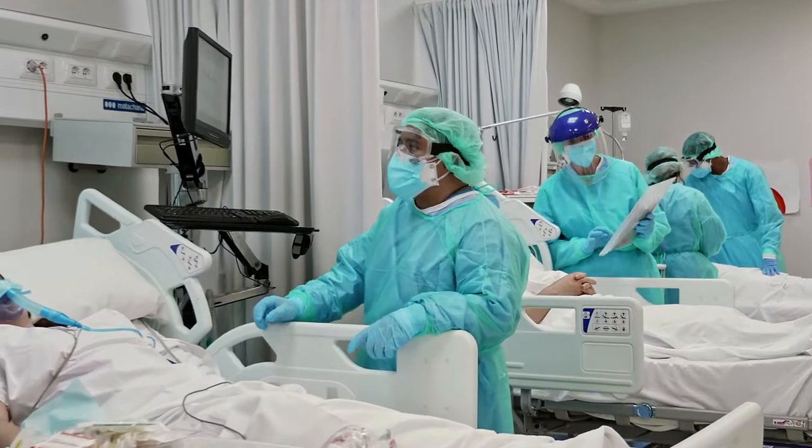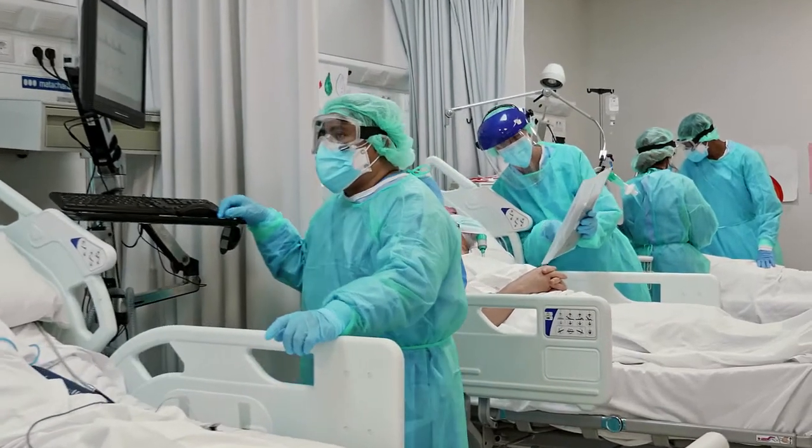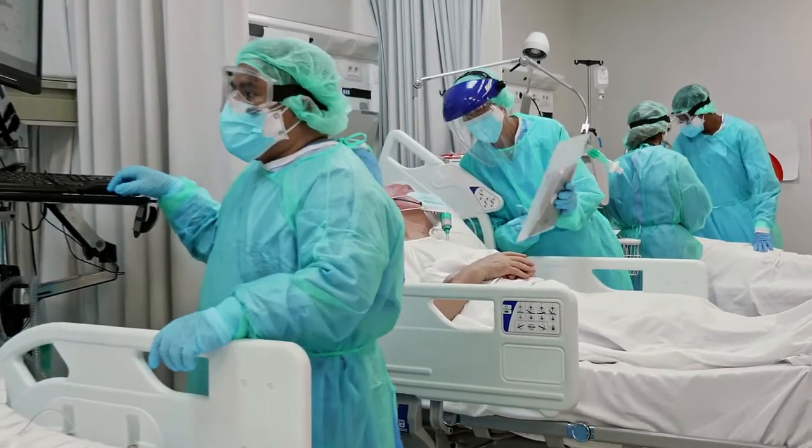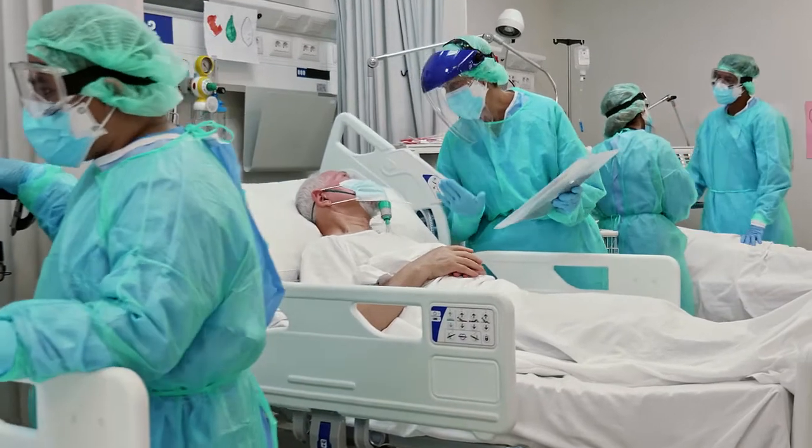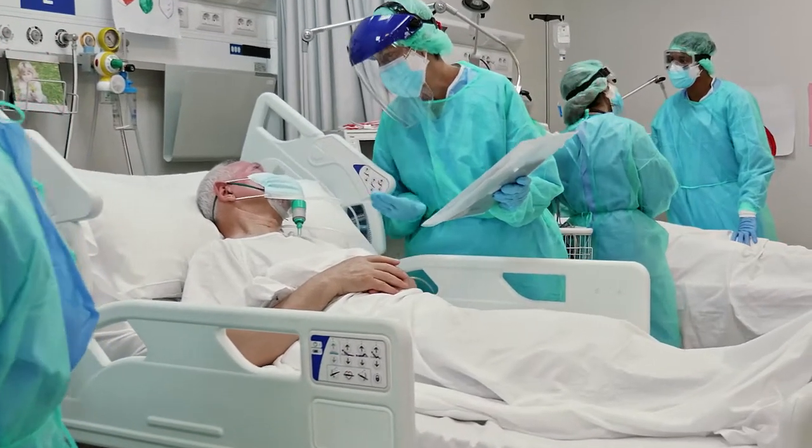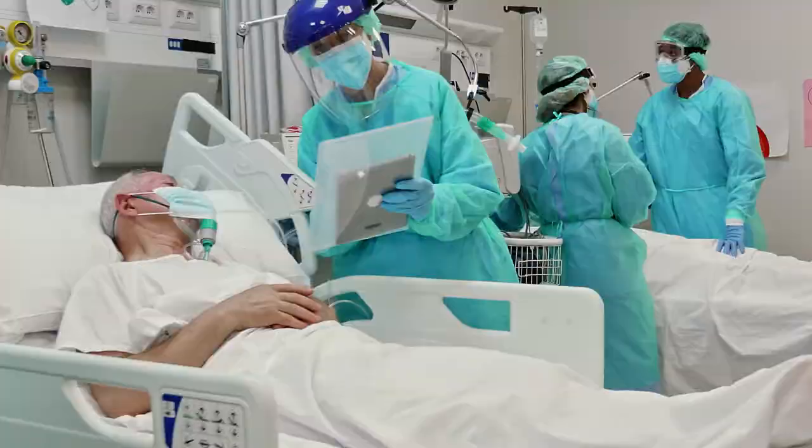Our team came together and identified an area that was really suffering - the medical community with respect to PPE, having to reuse single-use PPE. That was a terrifying concept to our medical community and the reliance on already used PPE to keep them safe.